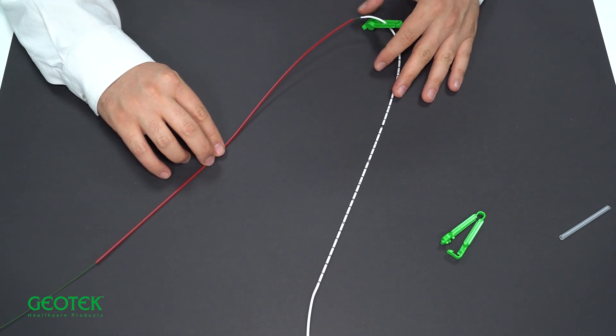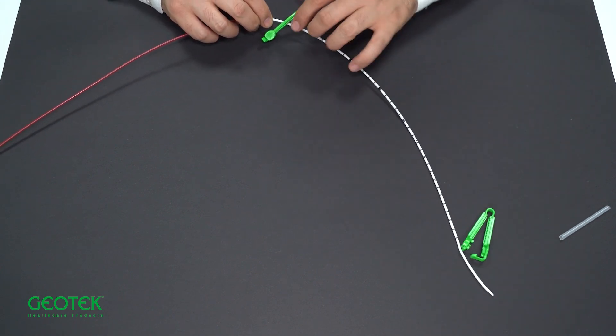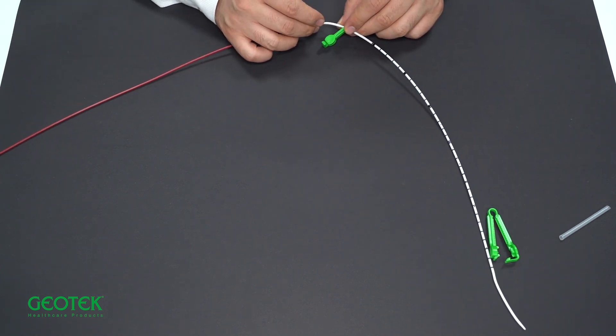When we see that it reaches the ureter through our cystoscope, we can open the clip and pull the guidewire.